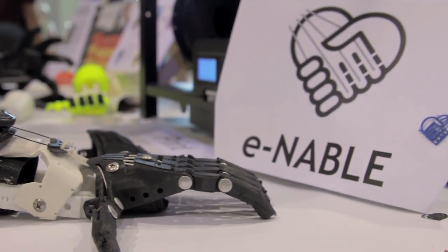My name is Andreas Sebastian. I'm here with e-NABLE. We're a large open-source distributed community entirely based on the web, and we make low-cost 3D printed prosthetic hands.